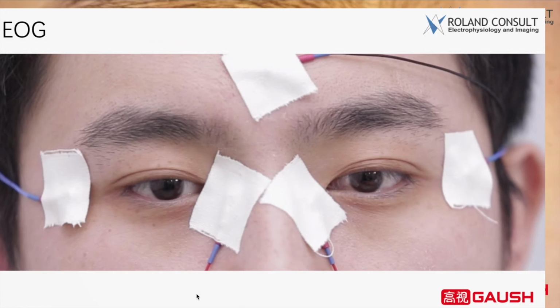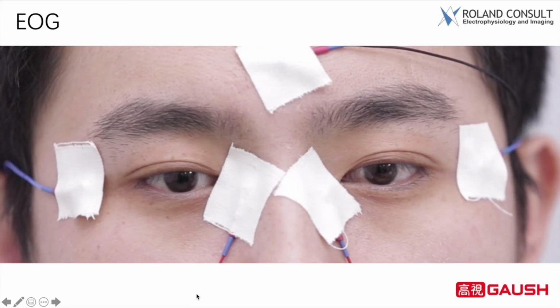The EOG recording electrode can be a silver chloride electrode or a gold cup electrode. EOG requires 2 recording electrodes per eye, with no difference between active and reference electrodes. The 2 recording electrodes in the right eye are connected to amplifier channel 1 and placed in the outer canthus and the inner canthus of the right eye. The 2 recording electrodes in the left eye are placed in the outer canthus and the inner canthus of the left eye, connected to amplifier channel 2.